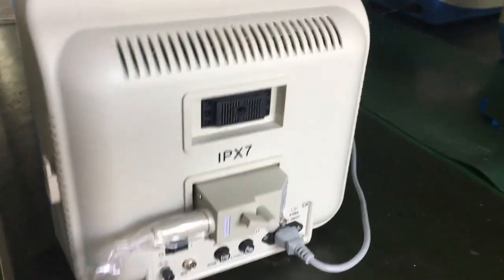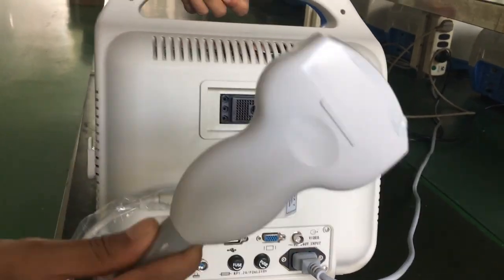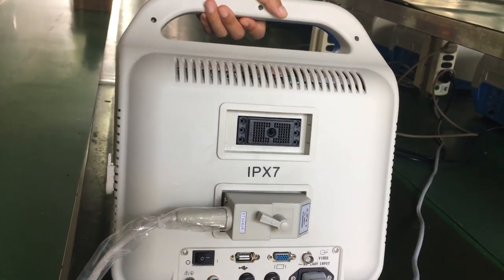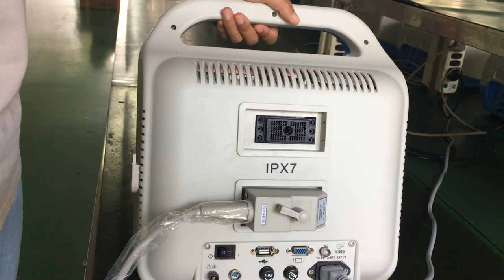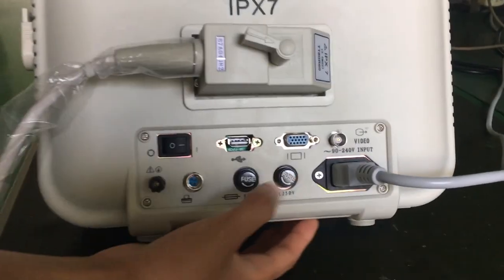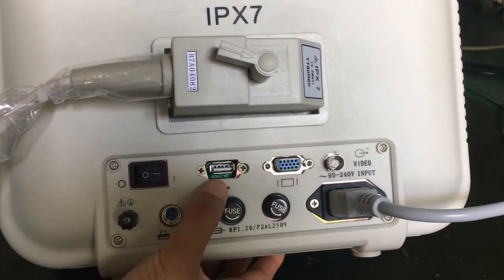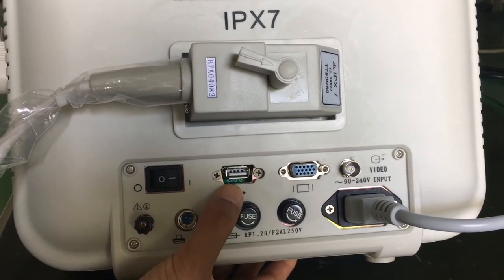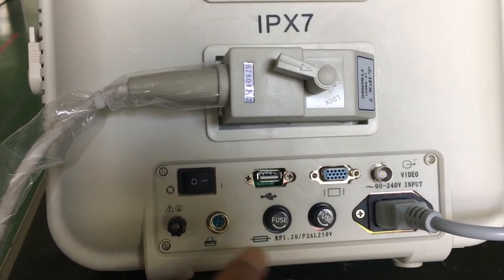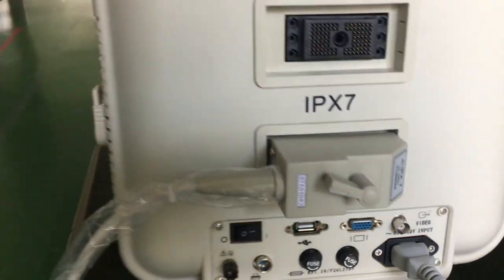This machine is laptop type. You can see there are two probe sockets — the second one is for convex use and the first one is for the other three probes. There are also many ports: a video printer port, USB port, VGA port, printer port, fuse, and power.